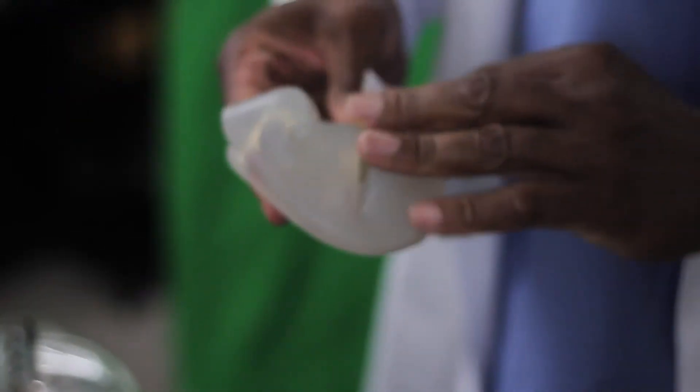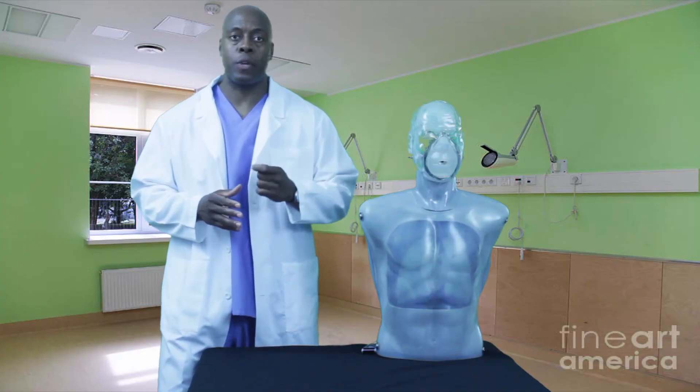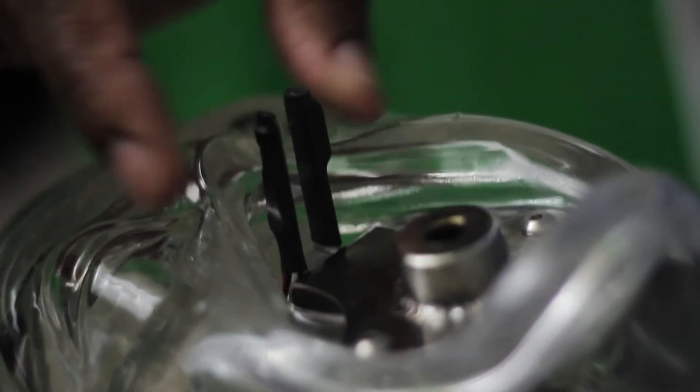The mouth and nose piece is made from rubber silicone, which can be removed and easily cleaned. Right below the mouth and nose piece lie sensors that are able to detect the correct amount of pressure when pinching the nostrils.